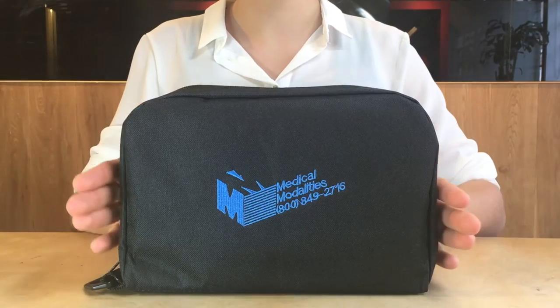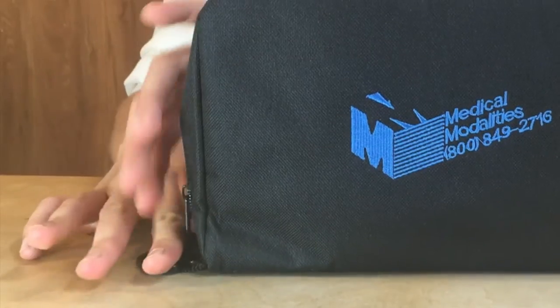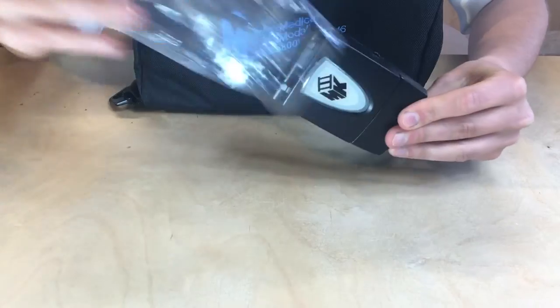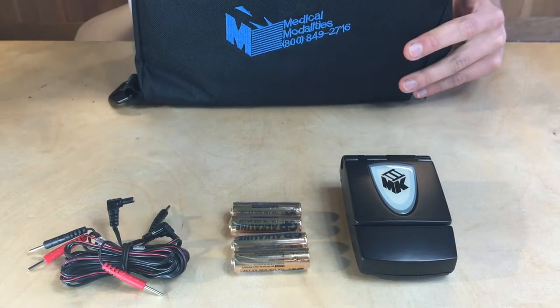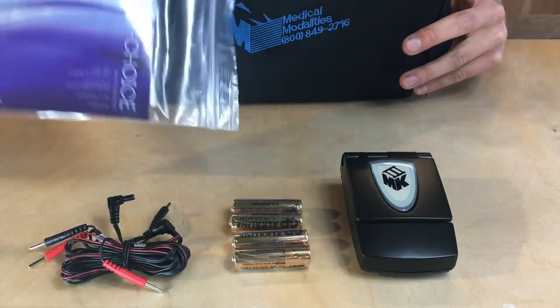We will first cover what you will receive with your MK3 device. If you open the carry case, you will see the MK3 device, lead wires, two sets of AA alkaline batteries, electrodes, skin preparation wipes, and a user manual.